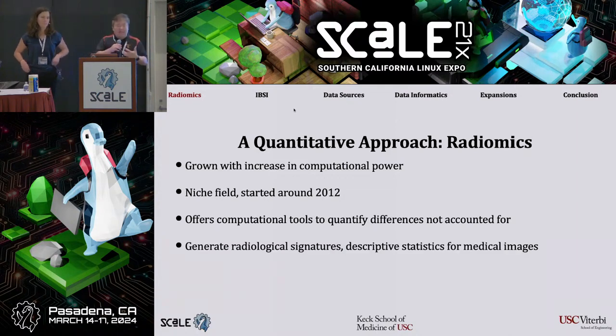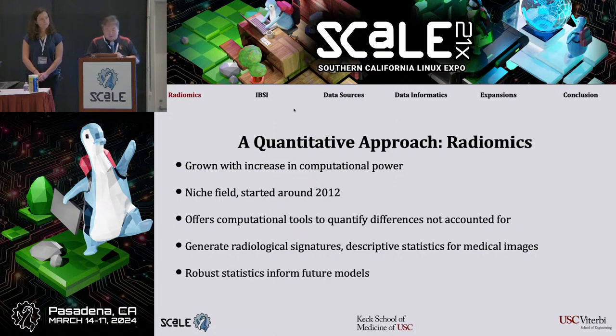And then the entire idea is to generate these signatures of certain things like disease or normality or pathology that can be associated with looking at the images on a higher level than being able to spot the differences, which radiologists are well trained to do right now. So these are subtle things that might not be able to be discerned by the human eye. Like one texture analysis of an area is a little bit fuzzier than another, or there's a slight shift in contrast enhancement. These kind of little subtleties, computers are great at extracting out, but humans don't necessarily are able to see that very clearly.